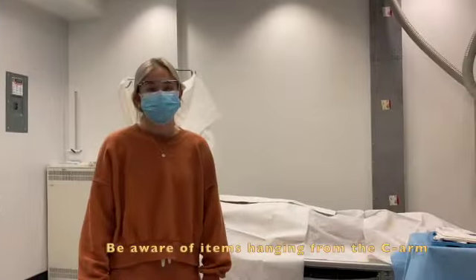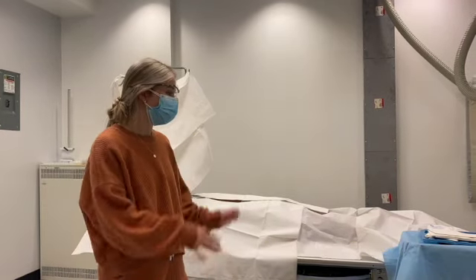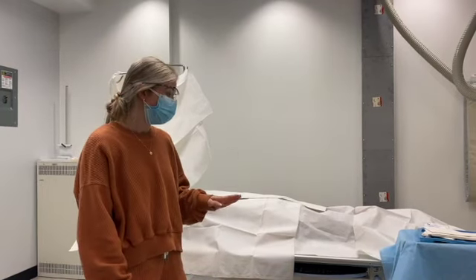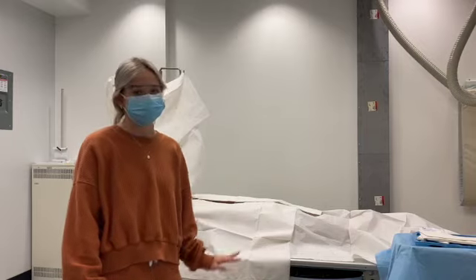The next thing you want to be aware of is equipment that might be hanging from the C-arm. So when you're moving the C-arm around the operating room, you want to be careful that lead aprons and items that are hanging from the C-arm don't contaminate the sterile field.